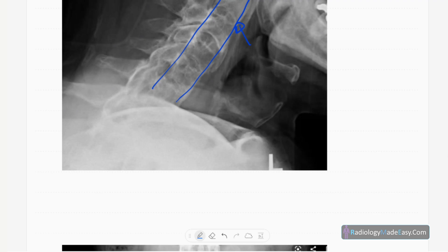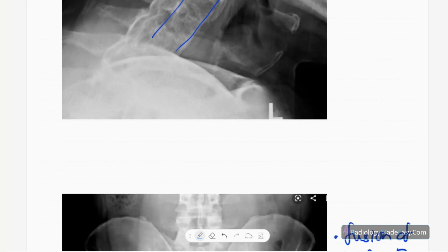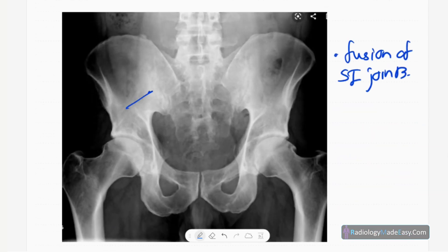One differential diagnosis is DISH — diffuse idiopathic skeletal hyperostosis. Here you can see fusion of the SI joints with sclerosis of the articular surfaces and fusion of the SI joints with sclerosis.